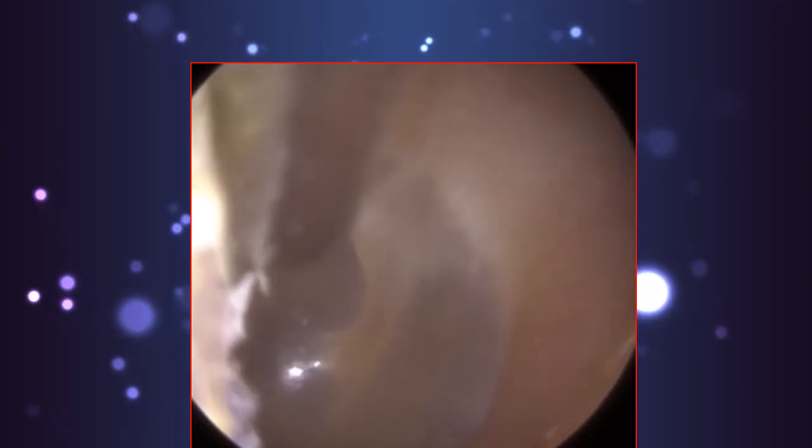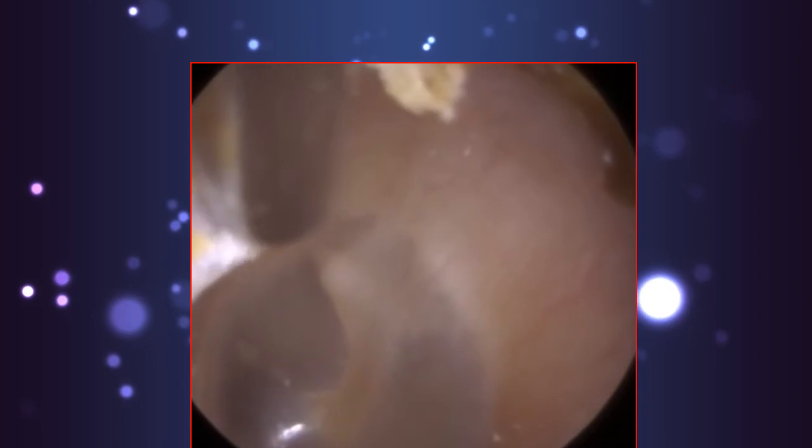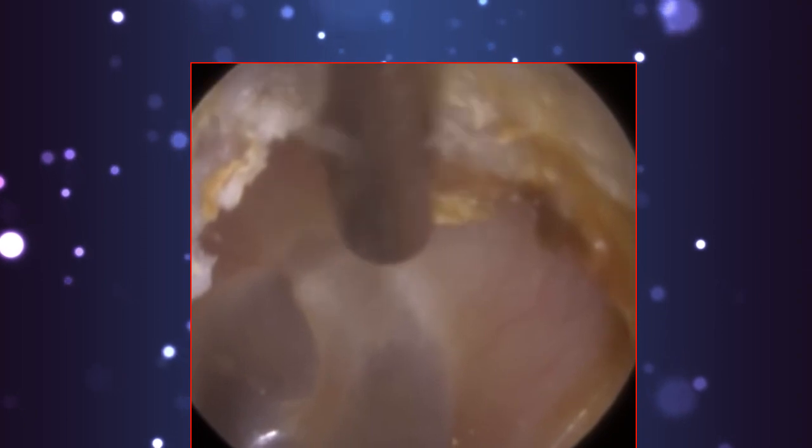So the best advice I could give was, obviously, that they follow all the precautions when they're performing ear irrigation. So the tank itself, they're sterilising that every day. There's a special tablet. When you have your ears irrigated at the doctors or nurses in primary care, to kill any bacteria in the tank of the irrigation system, they use a special sterilising tablet. So they're doing that. They're doing everything else fine. The temperature of the water is what it should be. If it's too cool, you can get the caloric effect as well.